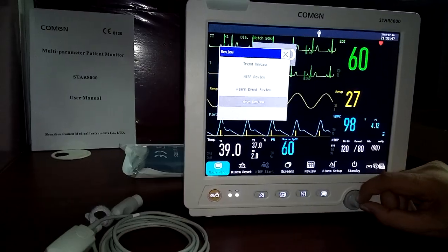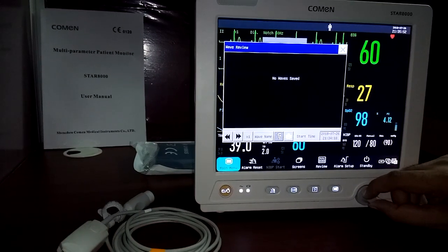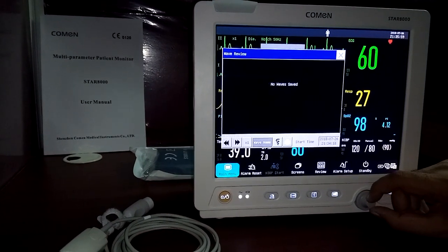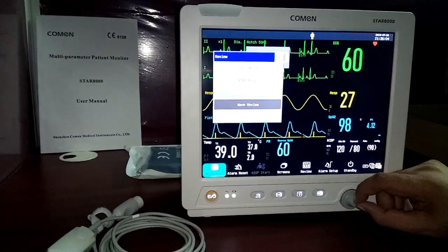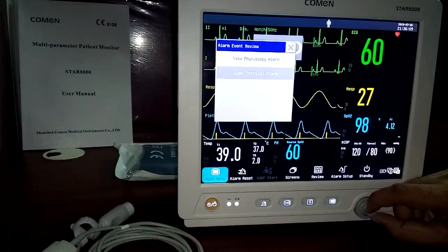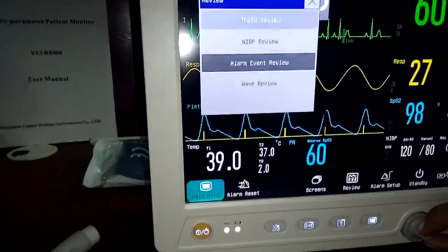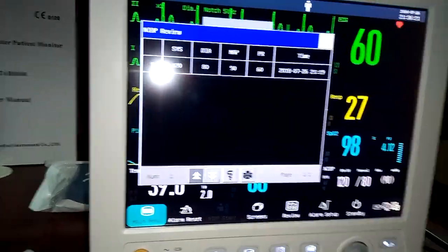Under the review option, you can access trends review, NIBP review, alarm events review, and waveform review. You can see detailed waveforms and print them if you have the built-in printer. You can view raw waveforms and review both physiological and technical alarms. The NIBP review shows the full NIBP measurement table.